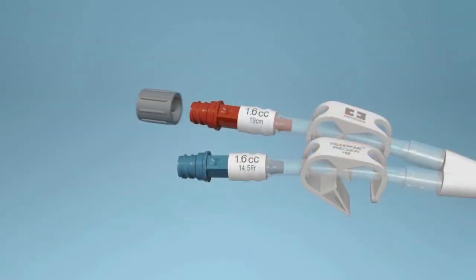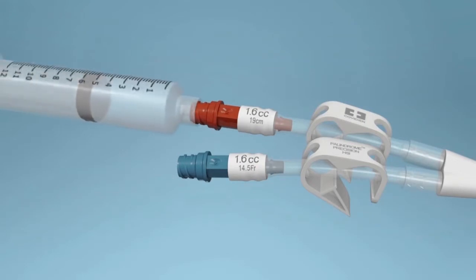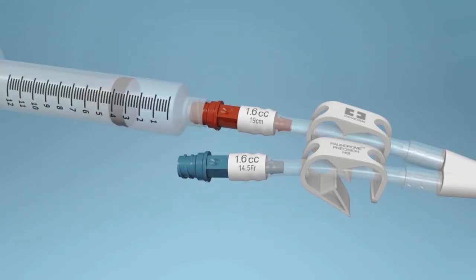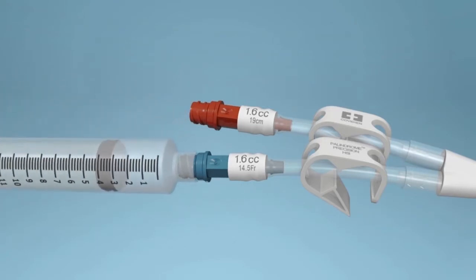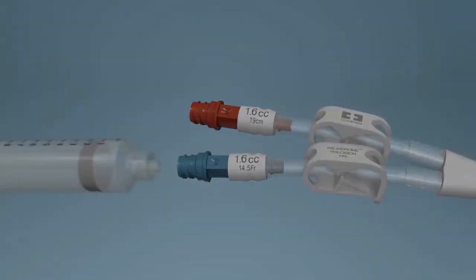Flush the catheter with sterile heparinized saline and clamp the extensions immediately to decrease the risk of air embolus during insertion. Keep the catheter clamped at all times when not attached to a syringe to prevent air from entering the catheter.